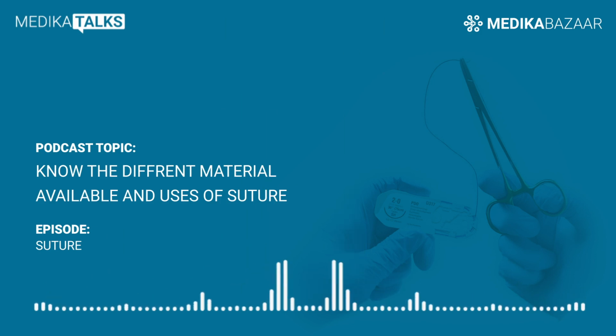What are the types of suture needles? Doctors use suture needles to place the sutures within the tissue. The needle carries the material through the wound with minimal residual trauma. Typically, these needles are rigid enough to resist distortion, but also flexible enough that they can bend before breaking. Depending on the wound being repaired, the doctor also uses a slim needle that can minimize trauma. At the same time, it should be sharp enough to penetrate the tissue with negligible resistance. The needle should be stable so that it permits accurate placement.